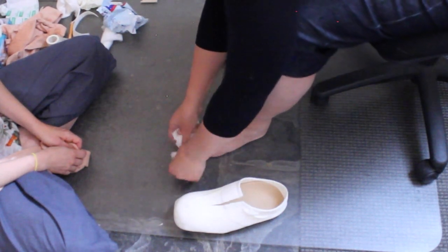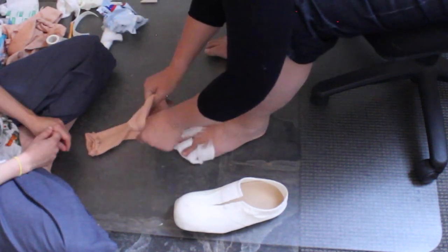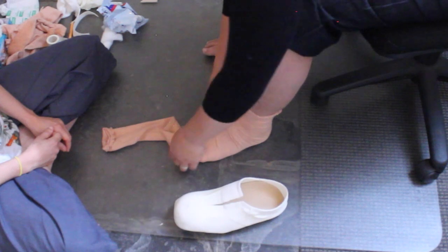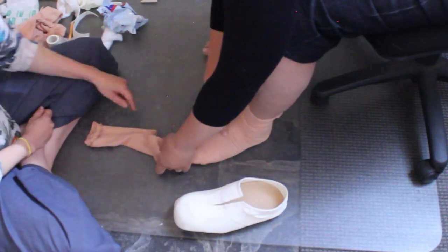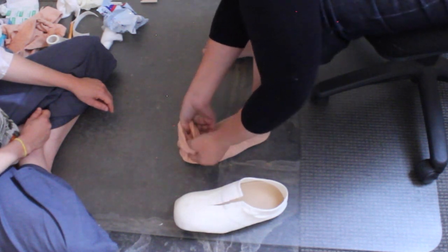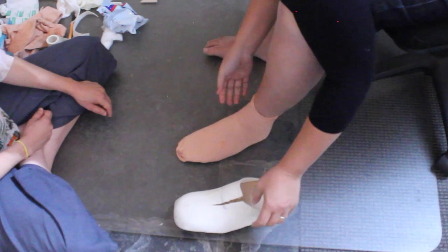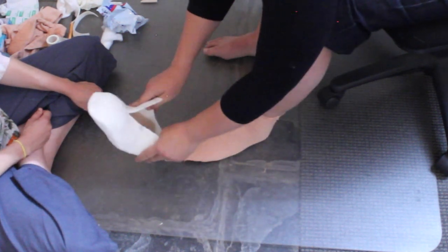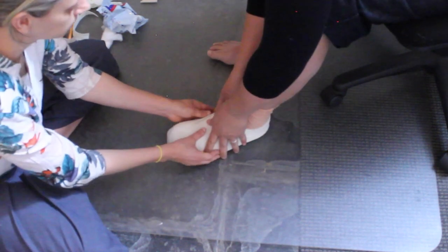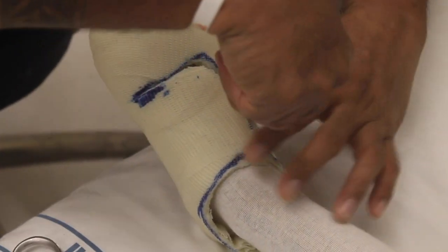Teach the client how to fit and remove the shoe safely. Place soft band or cotton wool between the toes. Apply a double layer of stockinette, avoiding wrinkles. The twist in the stockinette should be placed on top of the toes, away from any wounds. Clients should be taught this process and observed to ensure they are able to do it. Fit the shoe and observe them doing this process to ensure they are capable. The shoe should be taped together with sports tape until a permanent velcro strap can be added.